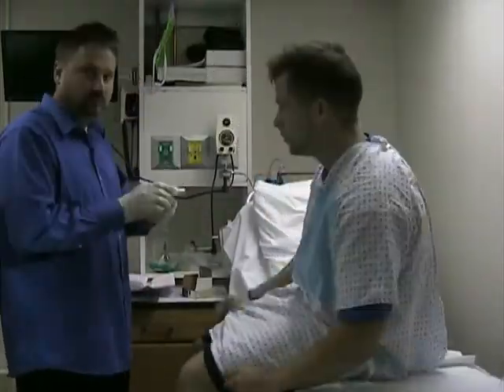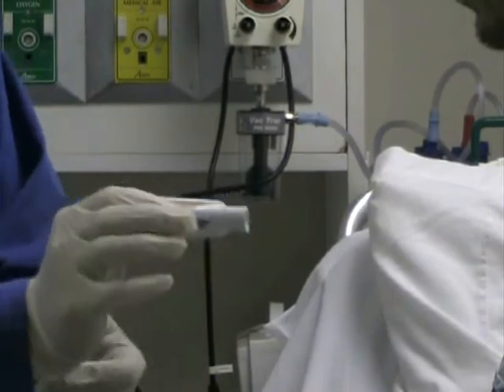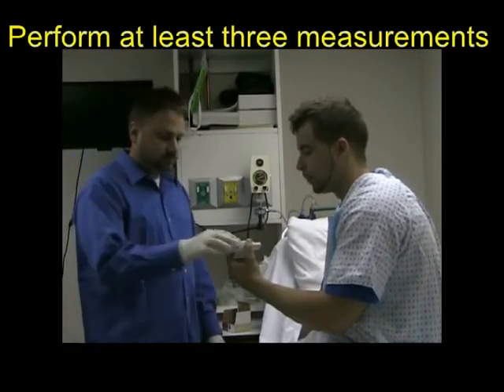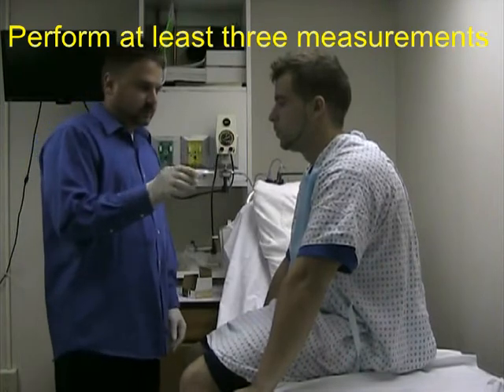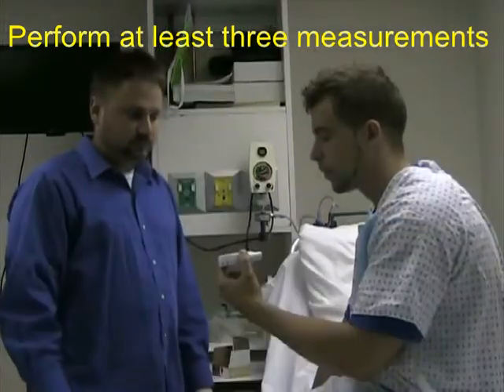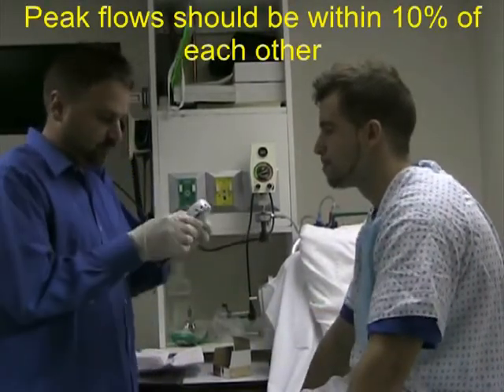Instruct the patient on use of the peak flow. When you do the peak flow, you want to hold it right here where these finger grips are, so you're not blocking any airflow and it will get the correct reading. Take a deep breath in, open your mouth, hold that breath, put this in your mouth, and blow into it. That reading is at 550.